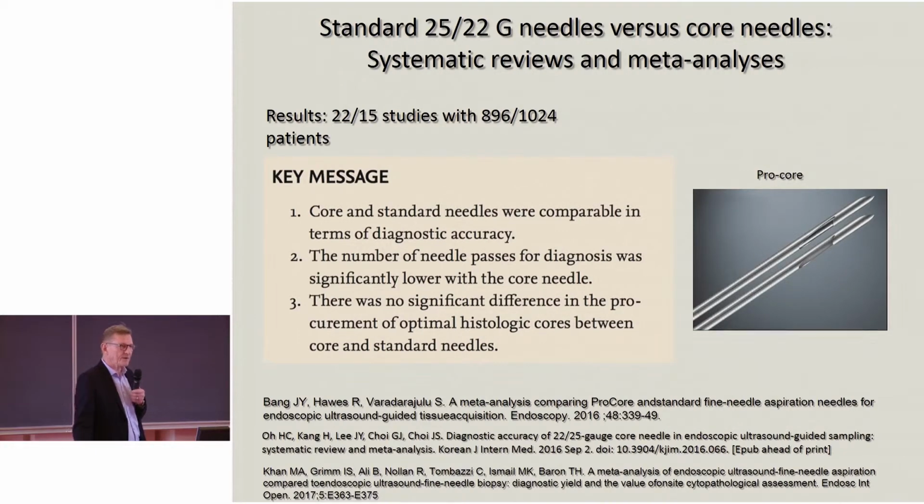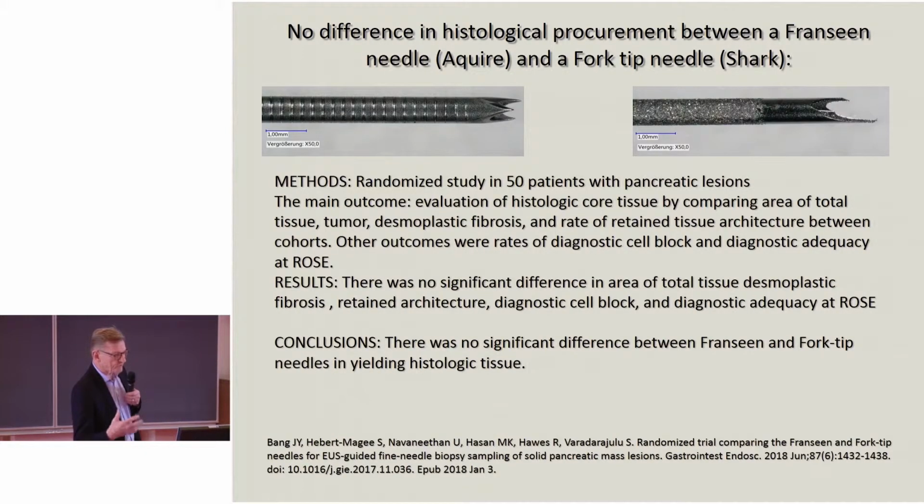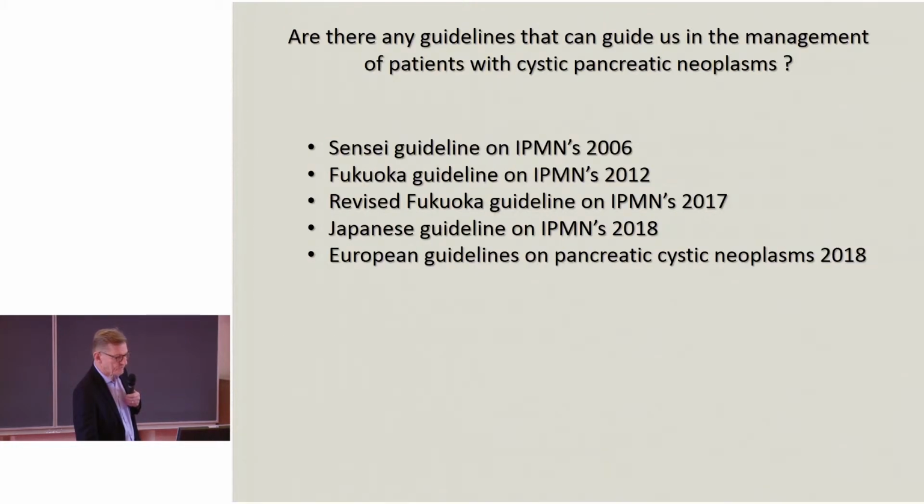We don't have any studies on FNB needles. Most of the studies are done with FNB needles on solid pancreatic tumors. So I can't give you any results on these needles with cystic pancreatic tumors.